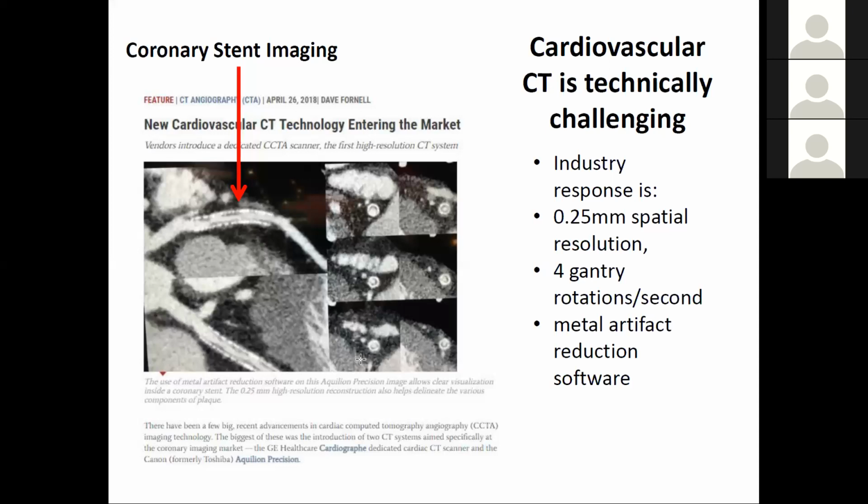Yes, this sounds good. And you just mentioned also that dual energy CT could be used for reducing metal artifacts. There's a huge signal in dual energy for where there is metal. And unless you're in the fully starved state, you can recover. You get a signal as to what the Z of the metal is, depending on whether you're fully starved or not. But even if you are getting towards starved, in the edges you'll be less starved. So everything gets better, right?